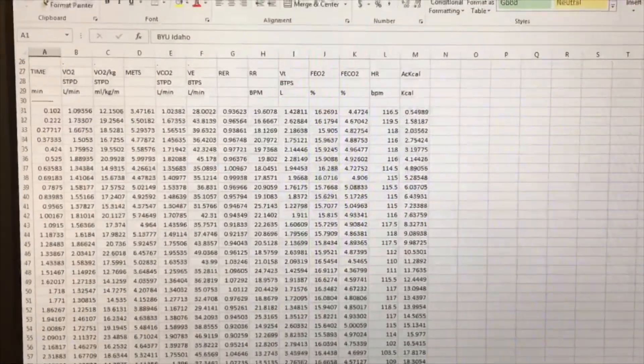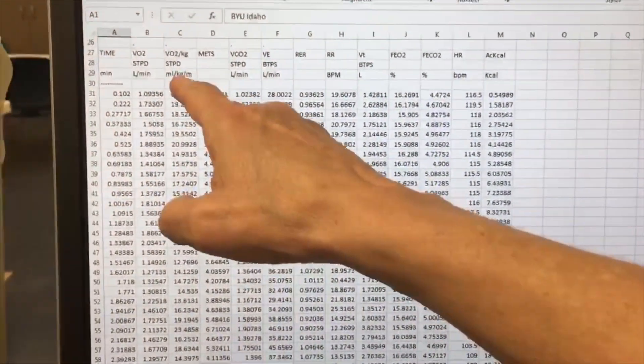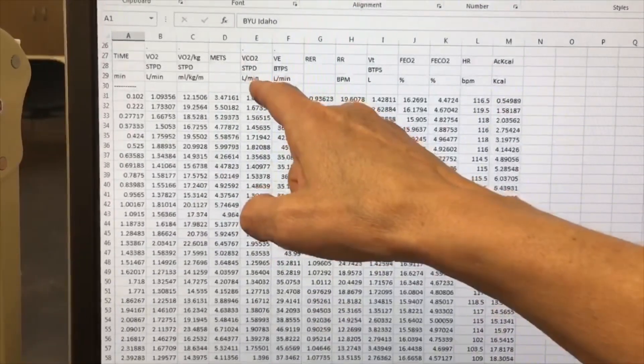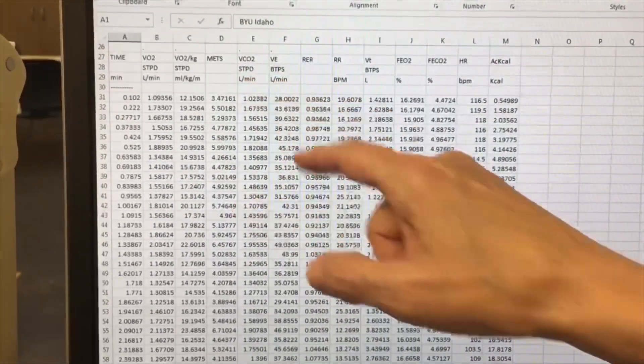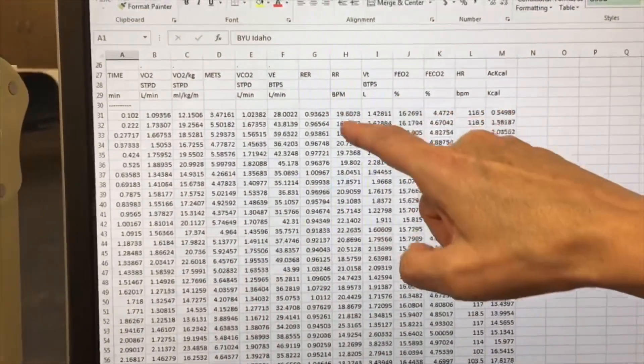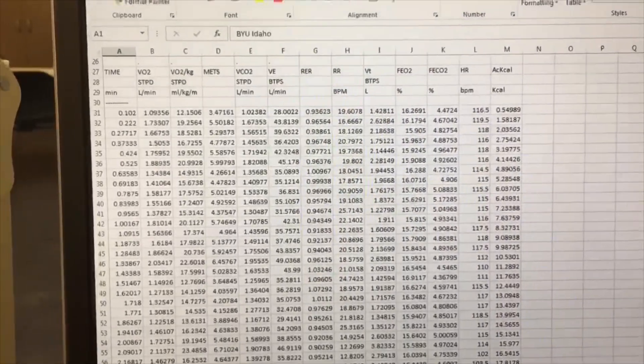We did an Excel export. You can see there's time, VO2 in milliliters per kilogram per minute, VCO2 measured in liters per minute, and other things you can look at. The RER is here, respiratory rate, heart rate, and even how many calories they burned.